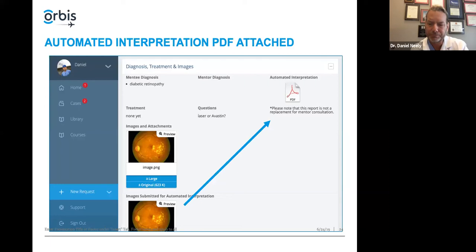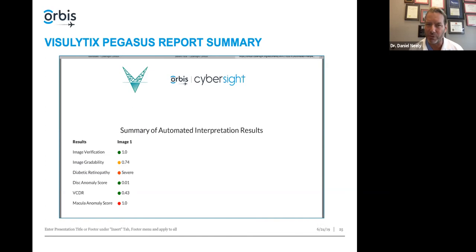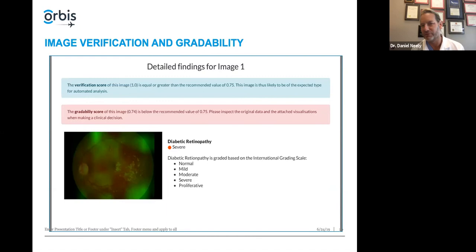The very first thing you'll see is a summary page of all the things being graded under the results column, with scorings under image number one. We'll go through these and explain what each of these summary grades are. The very first thing is a verification score — it's just verifying that this is a typical fundus photograph and that it's suitable for analysis. It's the right file, the right view, and it meets the parameters for the kind of images that need to be scanned. You're looking for this to be above 0.75. This image scored one — it's a perfect image.